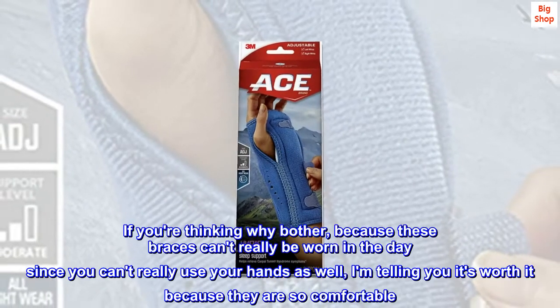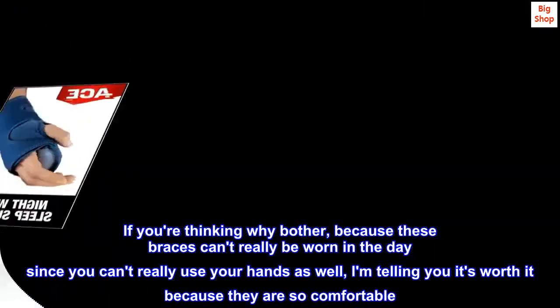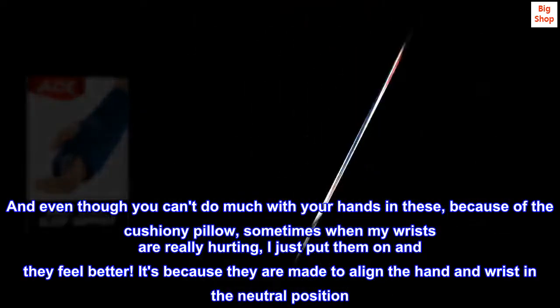If you're thinking why bother, because these braces can't really be worn in the day since you can't really use your hands as well, I'm telling you it's worth it because they are so comfortable.